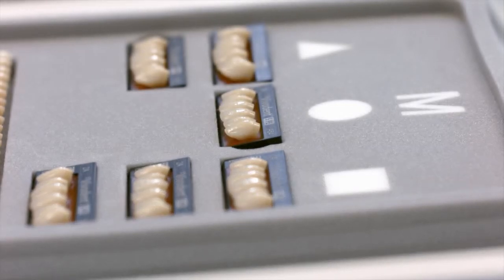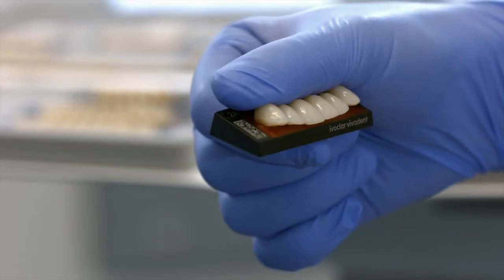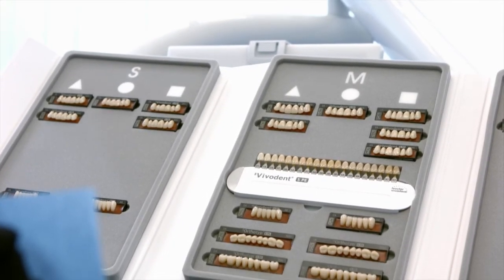Each tooth size range is available in the three basic shapes: triangular, oval, and square. The mold chart shows the tooth sizes in these three basic shapes. This helps you to identify the appropriate tooth molds with ease.